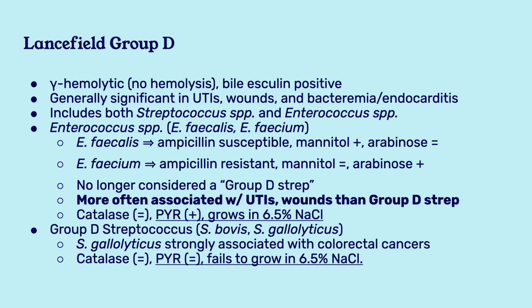It should be noted that Streptococcus gallolyticus is strongly associated with colorectal cancers. The presence of Streptococcus bovis and Streptococcus gallolyticus is generally not reported in wound cultures. However, they may be reported if the growth was pure and there were many whites present in the Gram stain.